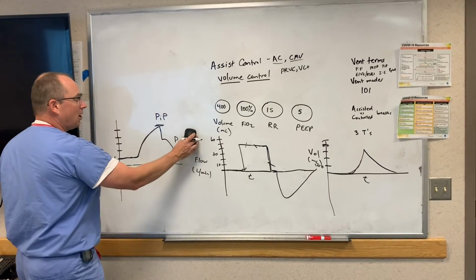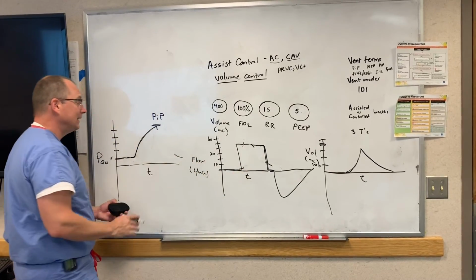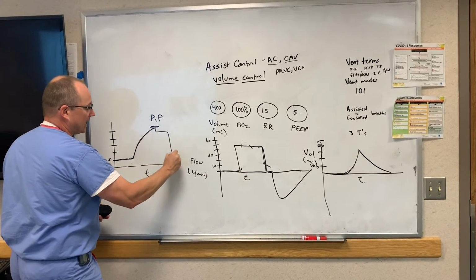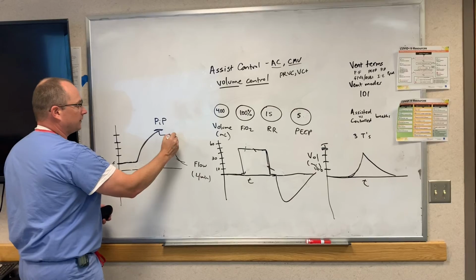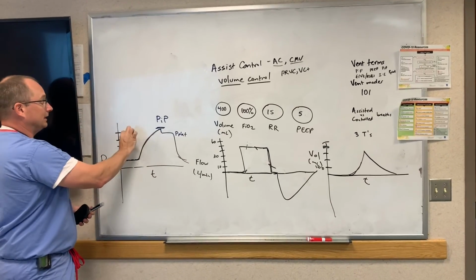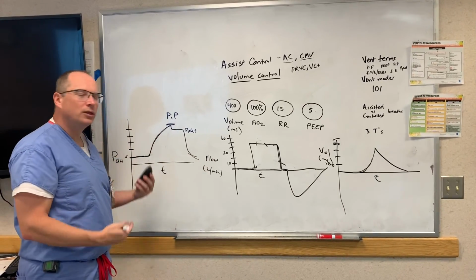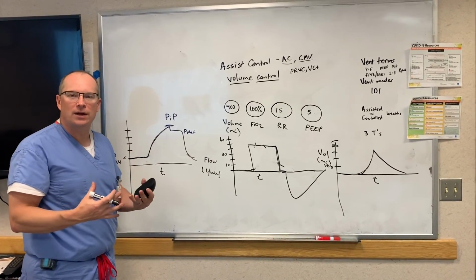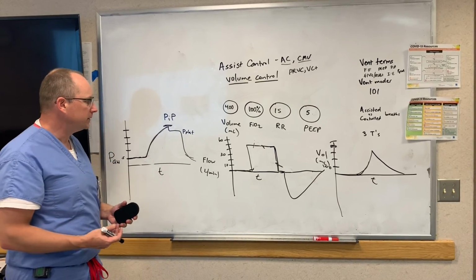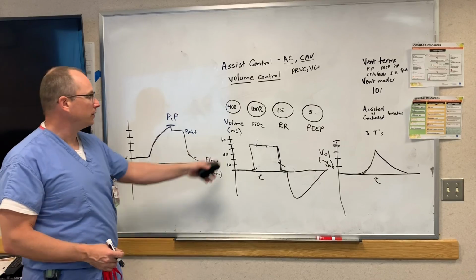What happens in ARDS is you stop flow and the pressure still remains high. And the difference between the peak inspiratory pressure and the plateau pressure is probably less than 5 even. And so you're dealing with a problem with lung compliance, and the lung isn't very stretchy, it's very overwhelmed with illness acutely, and it doesn't want to extend, and that's where the PEEP comes in handy.